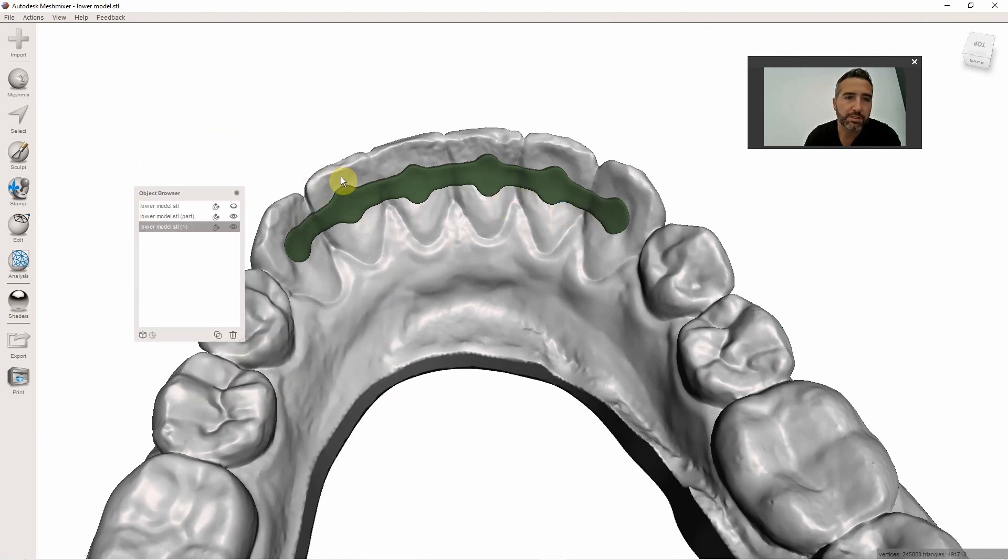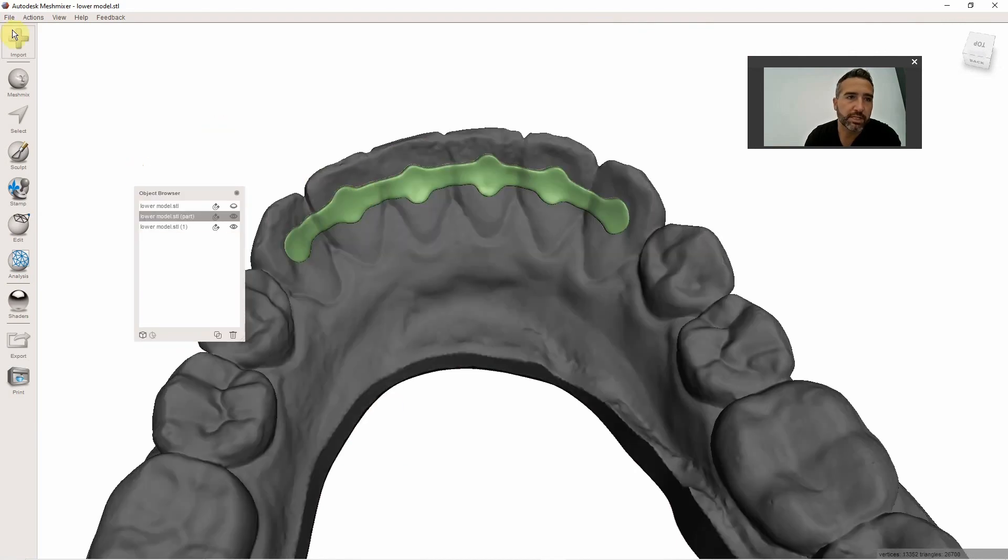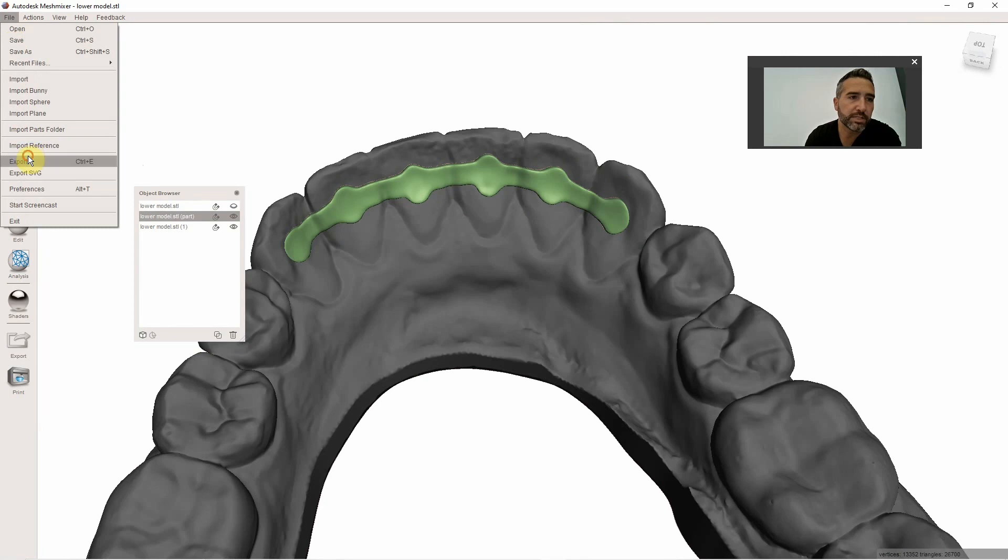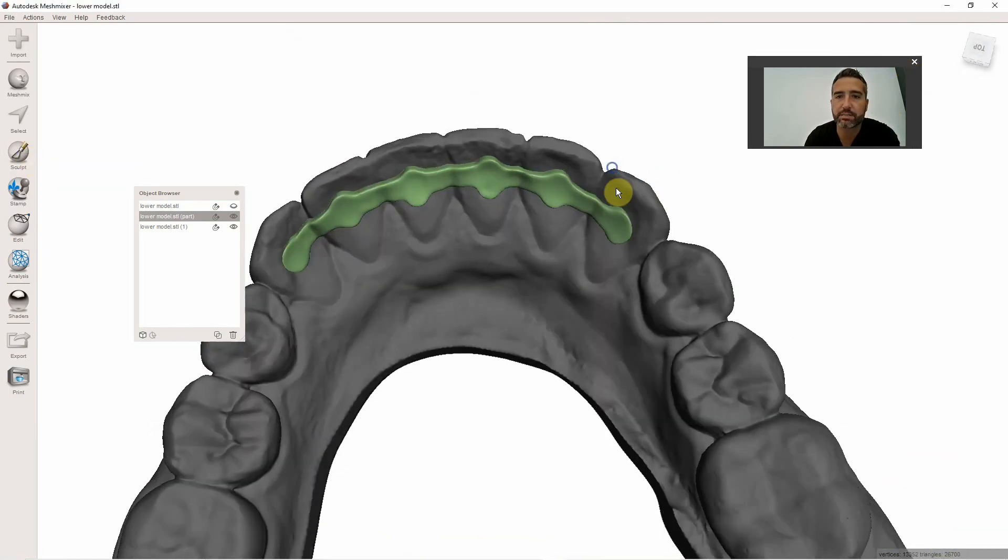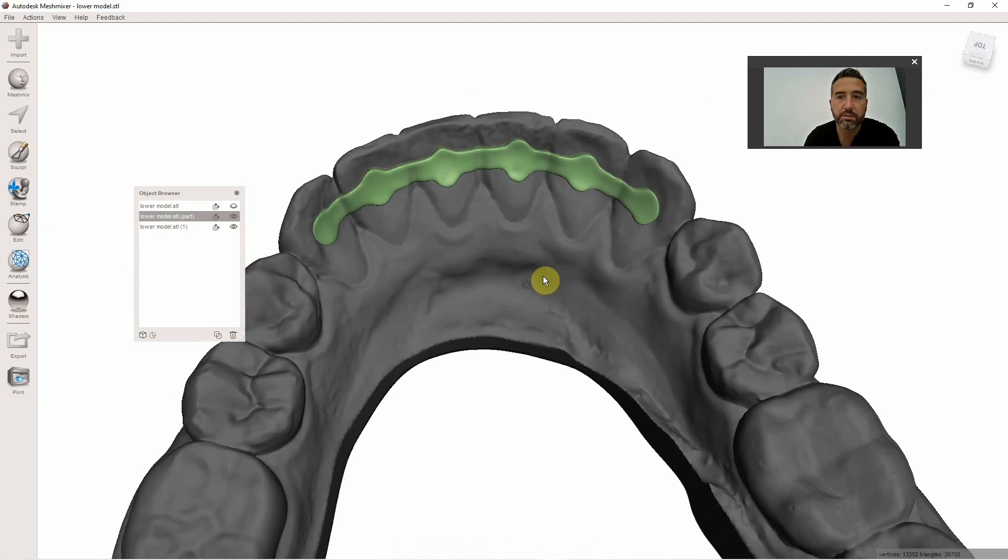So I will just go ahead and click that and go to File, Export, and save that STL as a binary STL and 3D print that sucker. So I hope this helps. Super easy to do these guys.